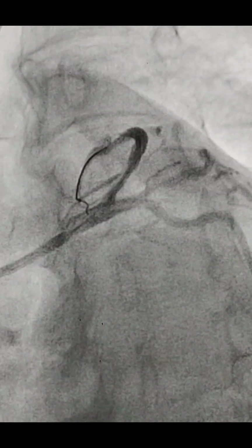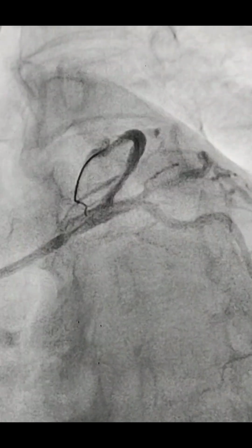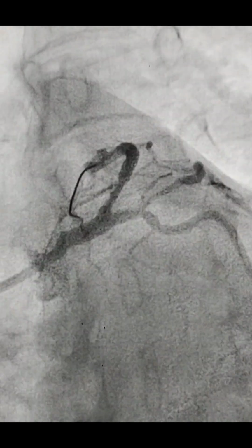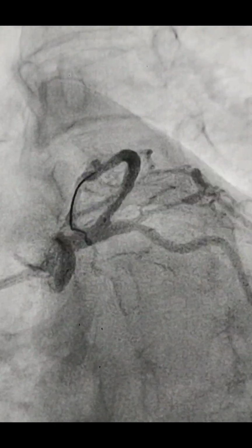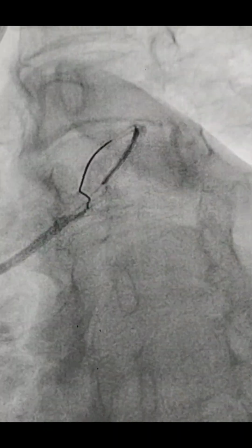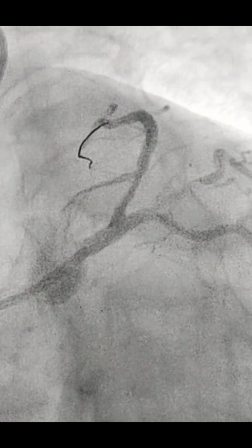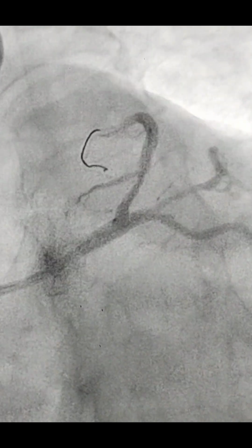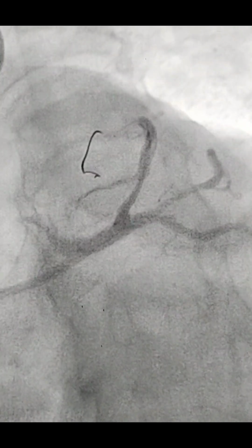Whenever we put a stent right from the ostium, or instead of doing crossover we do the nail-the-ostium technique, we need to see this in the LAO caudal view very carefully. This is the placement of the stent, and we pulled the stent so that 1 or 2 struts are in the LM. This was the shot before the inflation. You can see the 1 or 2 struts I kept in the left main, and this is called the nail-the-ostium strategy for the ostial LAD.